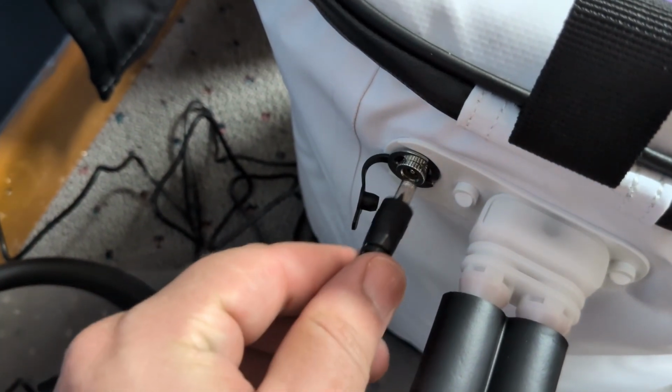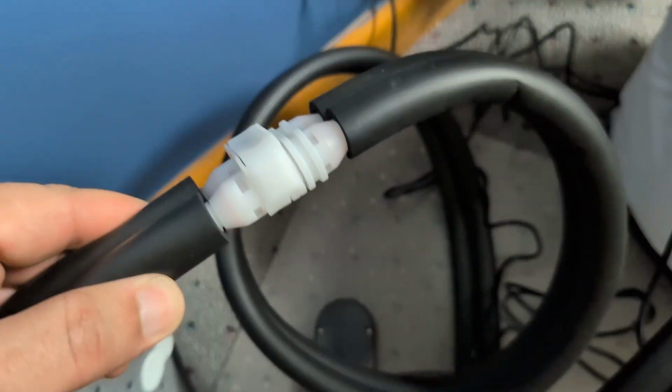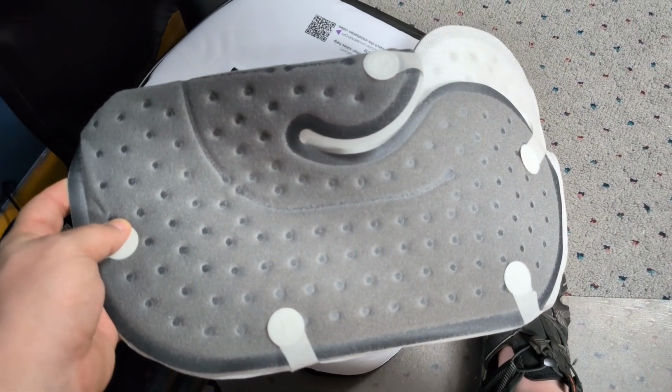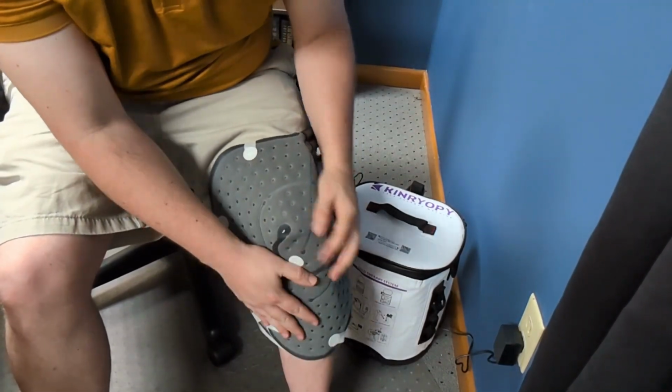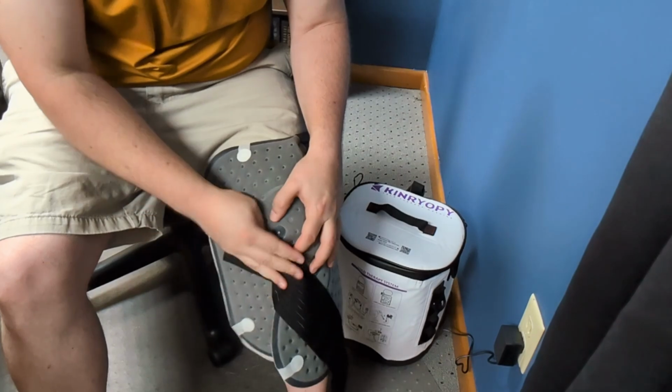To use it, you're just going to plug everything in, make sure your hoses are snapped together properly, make sure you fill up ice to the ice line down there, and then also water to the water line, no more than the max as it shows. Then just wrap the pad around what you want therapy on, and then wrap around the elastic band to keep it all securely in place, and then just sit back and relax.